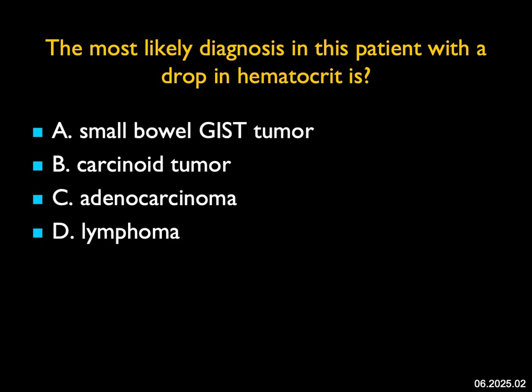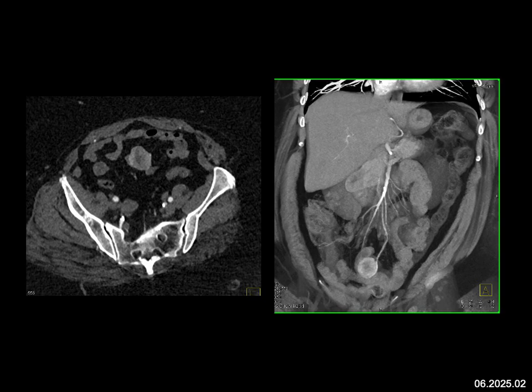The most likely diagnosis in this patient with a drop in hematocrit: we see a mass near small bowel way down in the lower abdomen. On the volume-rendered views, you see it's fed by branch vessels off the SMA, which are very vascular. The mass is abutting bowel. It could be a carcinoid tumor, but 70% of carcinoids do calcify, making it a bit less likely. I don't see a desmoplastic reaction.